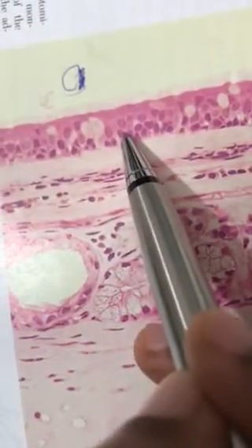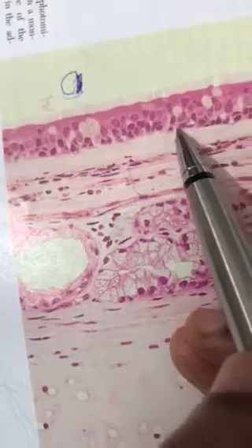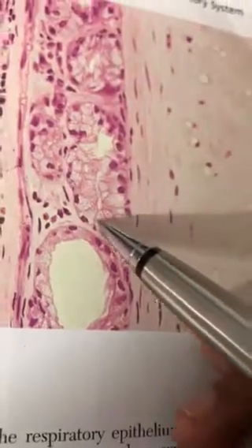So the cells present are number 1 ciliated columnar epithelium, goblet cells, something called basal cells, adult stem cells, and serous cells are also present, and enterochromaffin cells, enteroendocrine cells are also seen in the trachea. And what type of glands are these? These are all called seromucous glands. You could see that. These are all called seromucous glands. This is about the trachea.